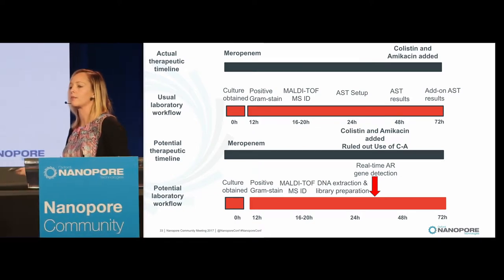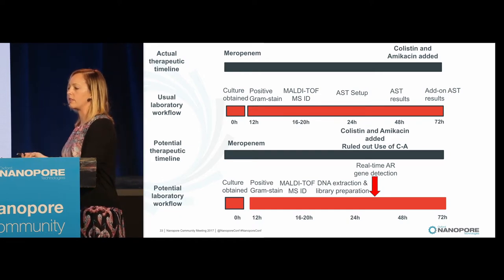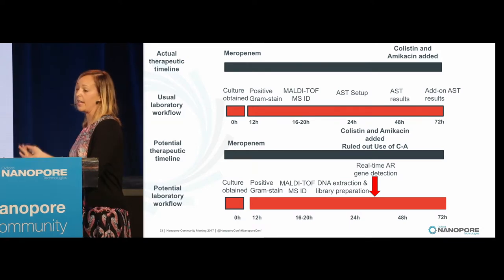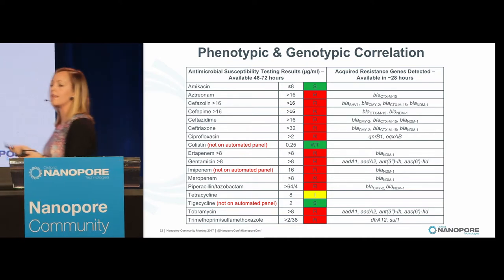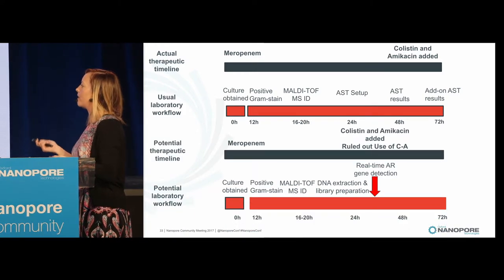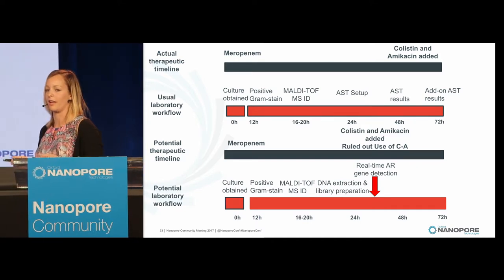critically ill patients when they become bacteremic, to get results a little bit quicker, we could have at 28 hours told them the resistance genes that were detected and could have predicted that they needed to add another agent at that point because it was positive for the carbapenemase-producing NDM, and this is one of those metallo-beta-lactamase producers. And so we could have also told them that ceftazidime-avibactam won't have any activity against this isolate because it is one of those metallo-beta-lactamase producers.